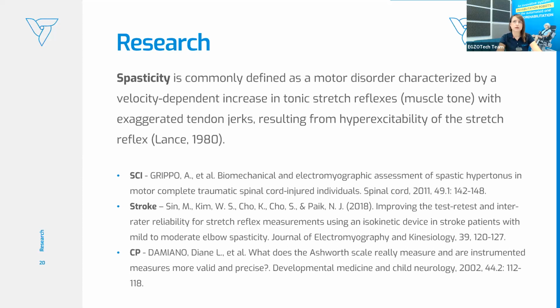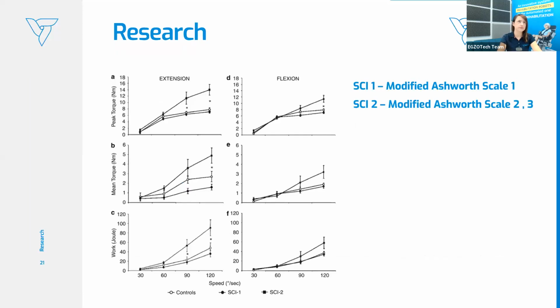So this is quite something that we looked at in previous years, and new devices are arriving on the market, also trying to measure that. But most of the time, it's devices like Luna or other isokinetic devices combined with EMG. So then you need two of them at least, or Luna.